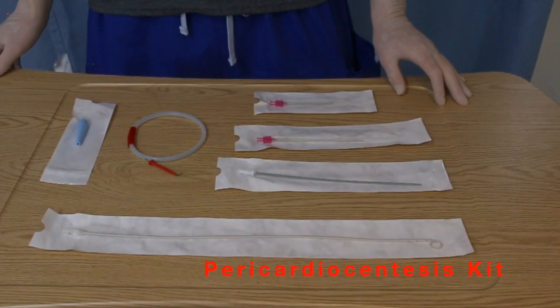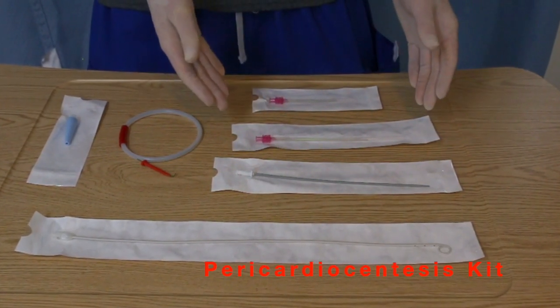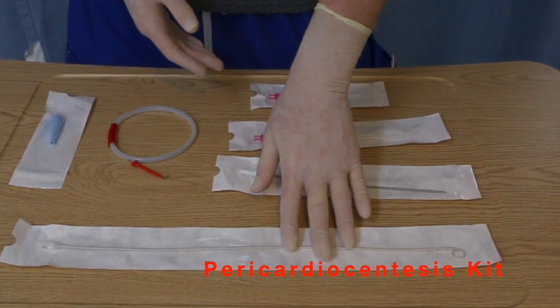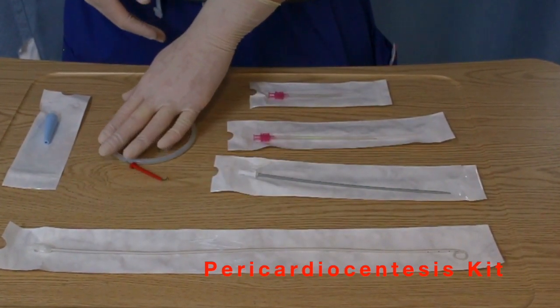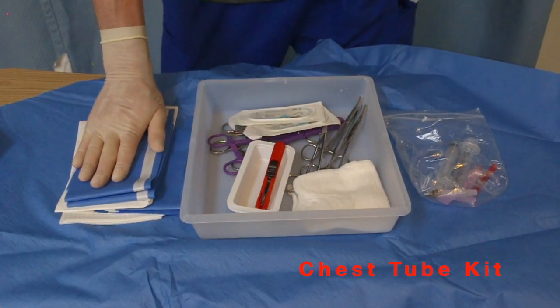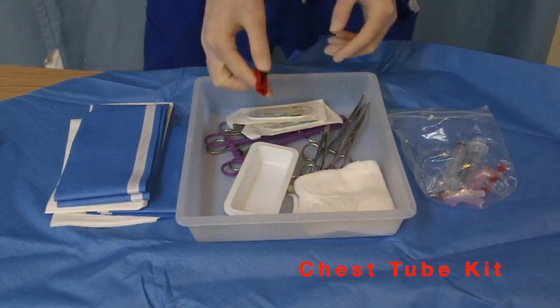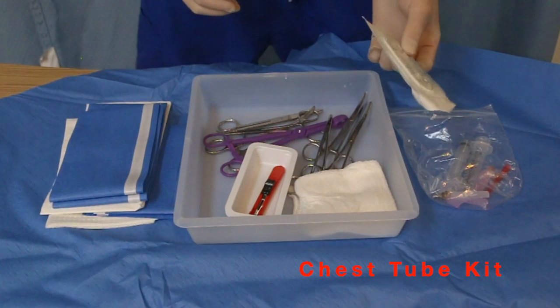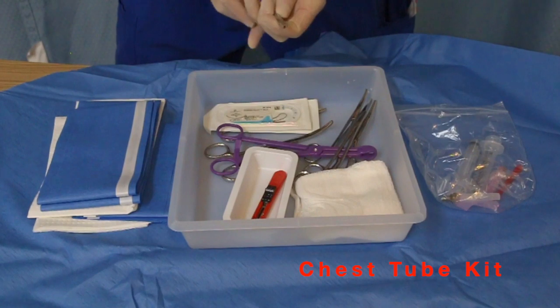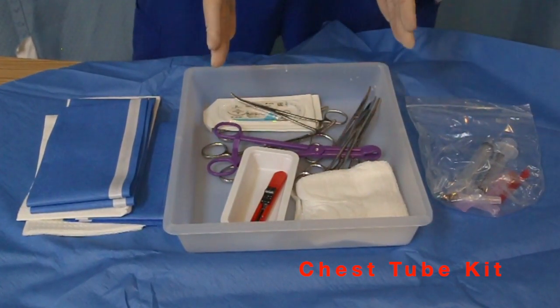In our commercial pericardiocentesis kit, the following is available: a short and a long 18-gauge steel needle, a dilator, a pigtail catheter, a guide wire, and a connector piece. The open chest tube kit includes sterile drapes, a scalpel to make the skin cut, sutures to secure the drain if you choose to leave it, clamps to clamp the drain, as well as the ability to set up a sterile prep area.